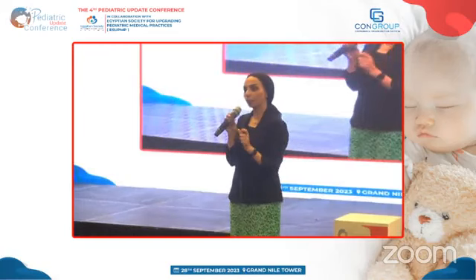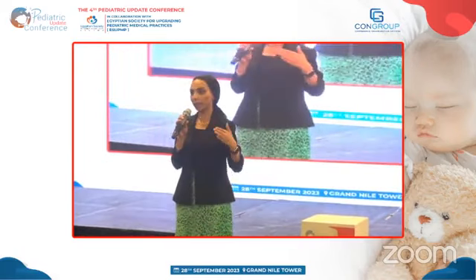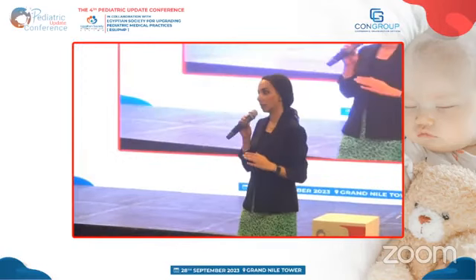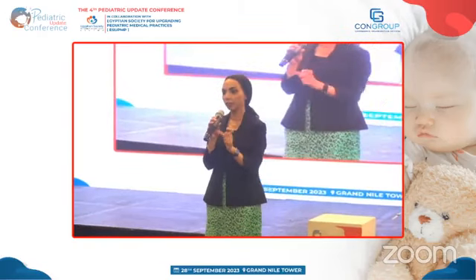في كوركشن. كل ما بقلل المدة بتاعت الأكتيف إنسولين تايم بقول للبامب بي مور أجريسيف إنها تديني إنسولين، لكن لما بكتر الوقت، بخليه فور إكزامبل على 4 ساعات، فأنا بقول لها بي لس أجريسيف ودي جرعات أقل. بيبان عندي قوي لما الاقي البيشنت بتاعي السيستم بيديله كوركشن، وبعد الكوركشن بيبقى عنده تندنسي للهايبوجلايسيميا، ساعتها بعرف ان الاكتيف انسولين تايم بتاعي ده اجريسيف شوية، فساعتها باخد الاكشن ان انا محتاج اغير في التايمنج بتاعي.